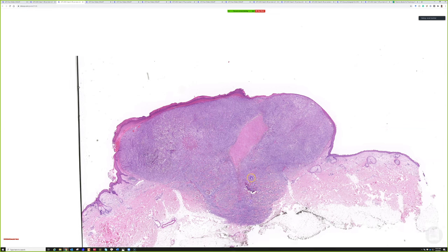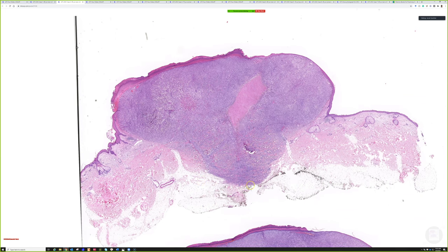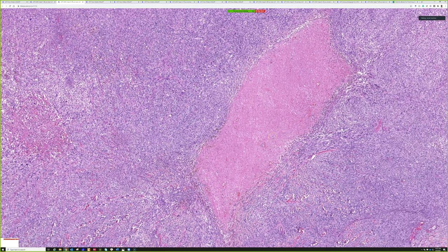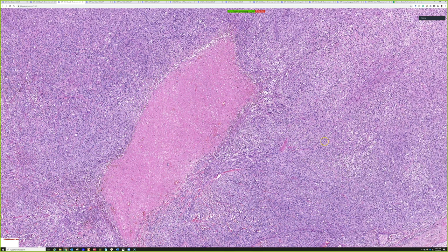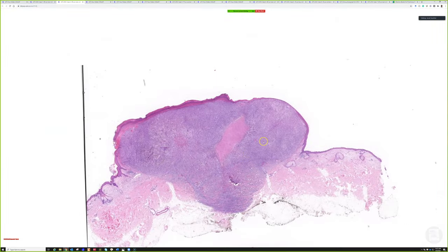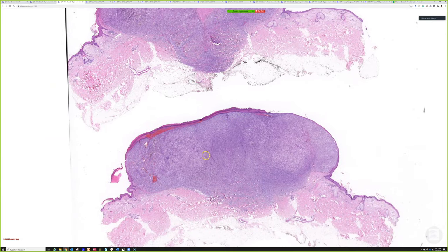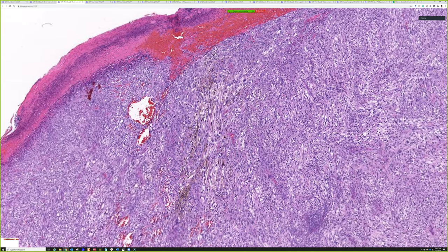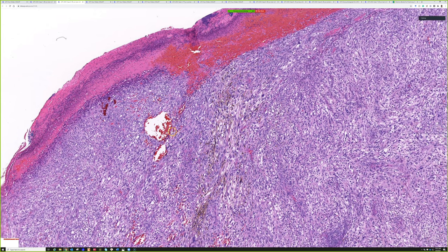This tumor extends into the subcutis, representing Clark level 5 if that's still being used, and is probably 12–15 millimeters in depth — truly bad. Large zones of necrosis are actually quite unusual in cutaneous melanomas; you really only see them in very large bulky tumors like this one. This melanoma has melanin pigment, though sometimes they are completely amelanotic. The visible melanin pigment here is a helpful diagnostic feature.